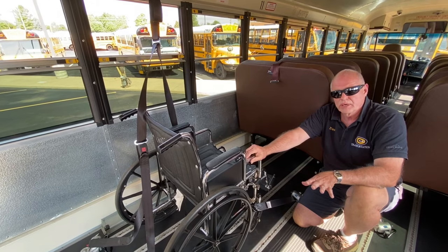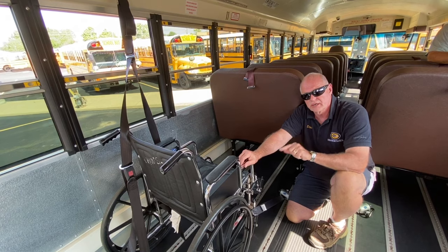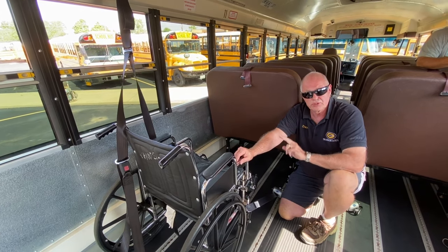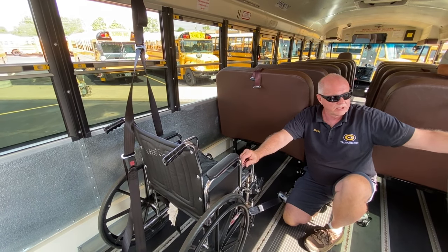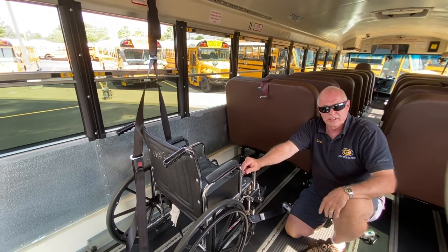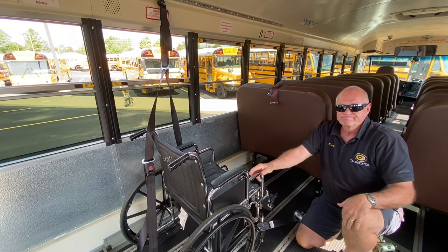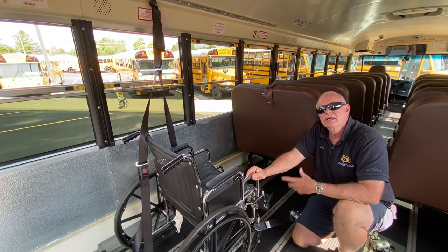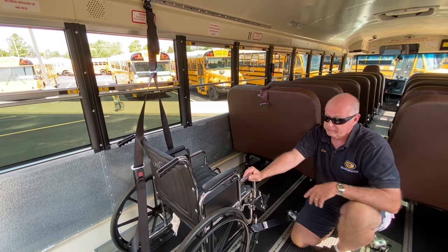When you're on the bus, both driver and aid are 100% responsible to tie this chair down. If you're both 100% responsible, it's going to get done. If, for example, a teacher is talking to someone and the other person gets distracted, you can't say 'I'm only responsible for the back hooks or the front hooks.' That's not a good idea — you could drive away with only two hooks connected, and that would be a bad thing.